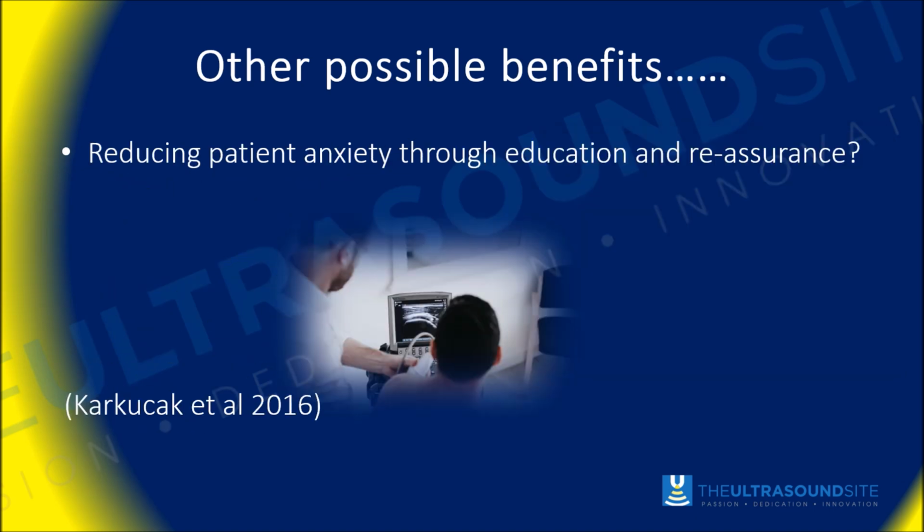There has been a study which has shown that performing ultrasound guidance, patients actually like to watch the guidance of the needle, and this can help to reduce the anxiety through education and reassurance. So again, these are some of the softer but also potentially very, very relevant advantages and benefits.